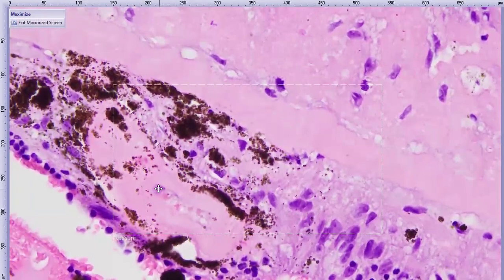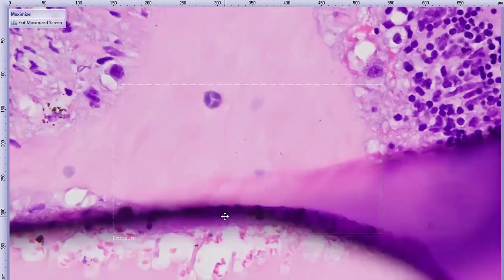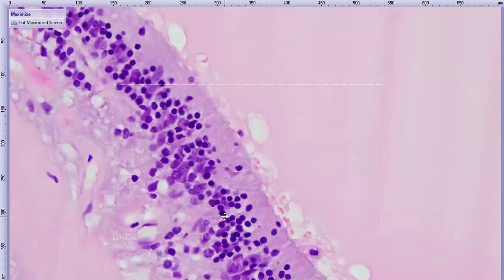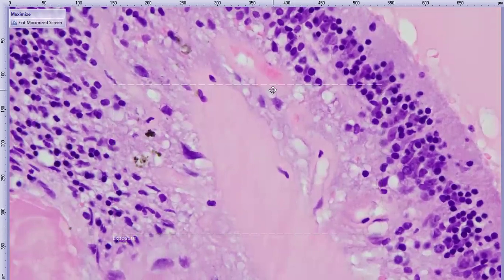And so here is the lumen of this vessel, or artist formerly known as the lumen of this vessel. We can see some endothelial cells, and the wall is markedly expanded by that same proteinaceous exudate. So there's some degree of periretinal exudation and perivascular exudation and vascular necrosis. You can see similar stuff here and there, right?